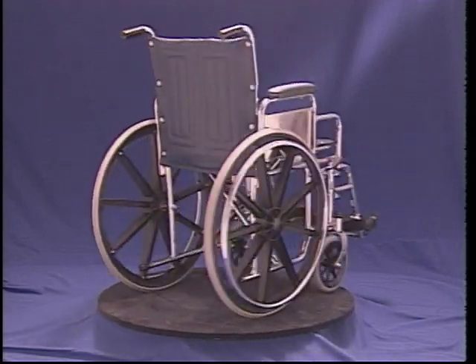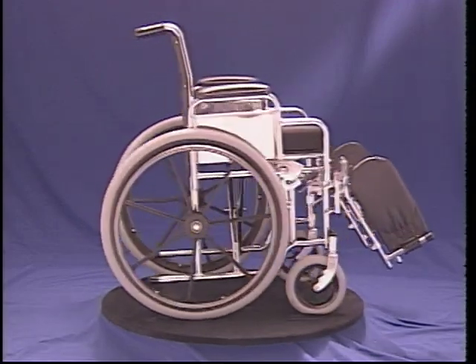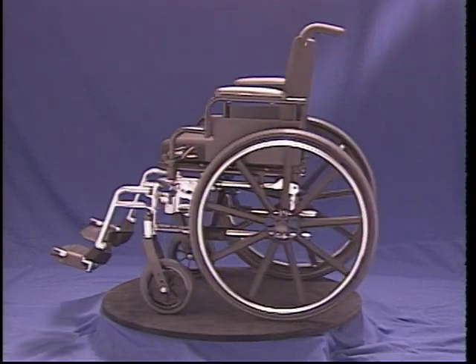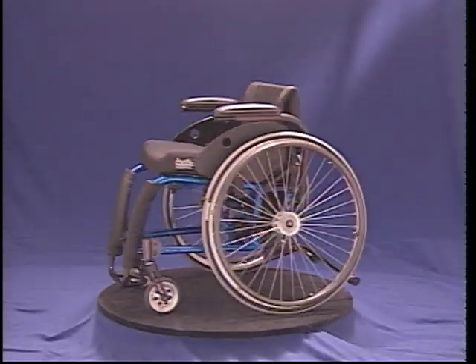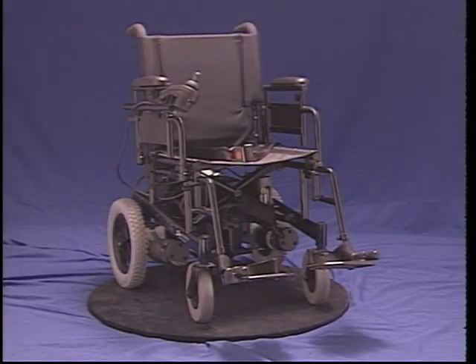Wheelchairs come in a variety of sizes and styles, and some are more adjustable and maneuverable than others. The major aspects of a wheelchair that affect mobility in the home are overall chair width, overall chair length, and turning radius. Briefly, wheelchairs can be divided into a few broad categories: the standard folding wheelchair, which is 40 pounds or over; the lightweight wheelchair, which runs 34 to 38 pounds. In addition, there are also high-strength lightweight wheelchairs. The ultra-lightweight wheelchair, which falls between 23 and 28 pounds, and motorized wheelchairs.